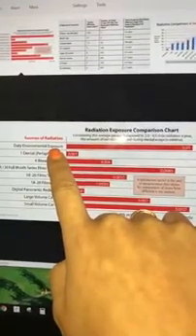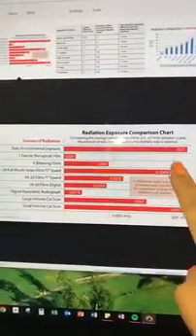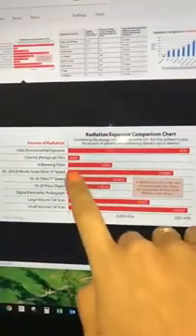So I was just looking at this, and I can flip it around to see if I can show you the chart. You can see the radiation exposure comparison chart. Your daily environmental exposure, so this is just what you get from walking outside, is 0.01 millisievert, and that's how we measure the amount of radiation. And then you look at a single periapical, 0.001. Four bite wings, which is the average for an adult, is 0.004.